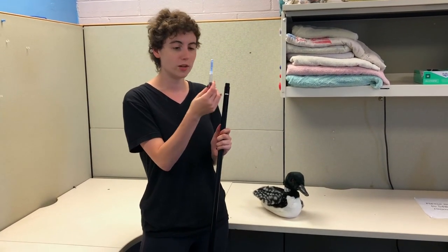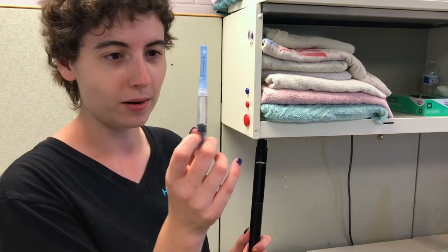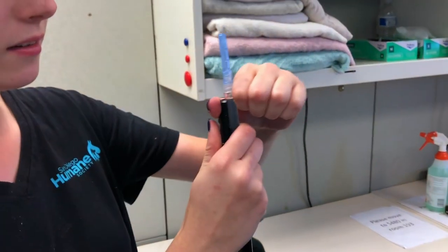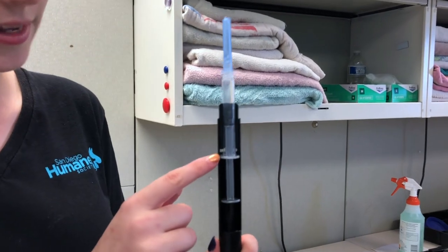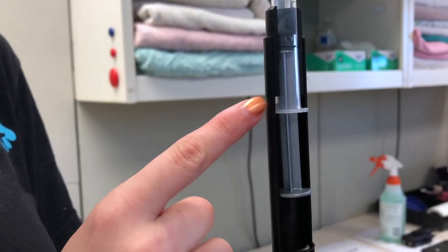You snap in the syringe when it's already been filled — in this case we're just filling with water because this is just a demonstration — and it just snaps right into place. Now that your syringe is snapped in, you'll see that it lines up with the little non-circular bits fitting in right here.